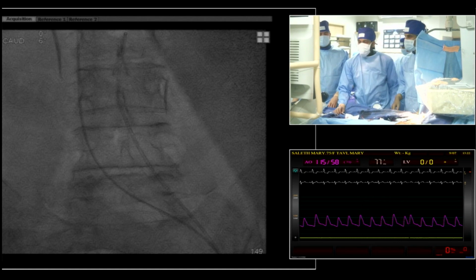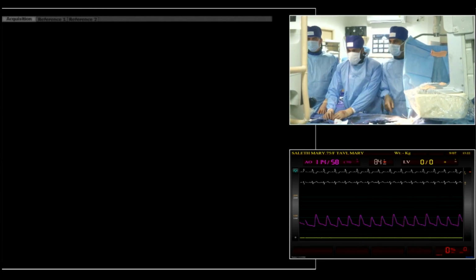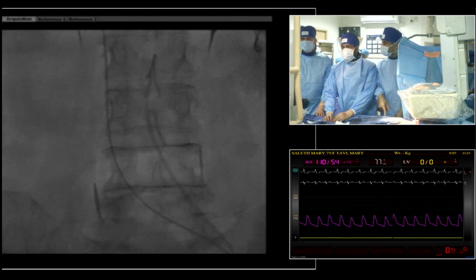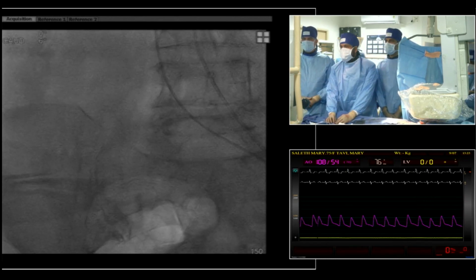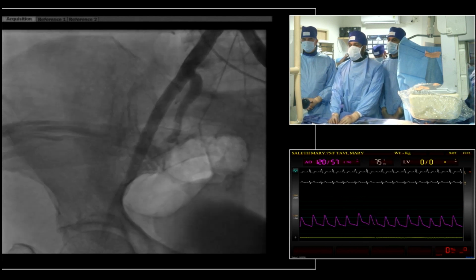Okay. So this is basically to prevent the cinching of the vessel. Is that right, Dr. Andrew? Show this side, Bernard. Okay, ready? Can you show this side? Do you have place to move? Okay, that's fine. Ready? We can do a selective injection?